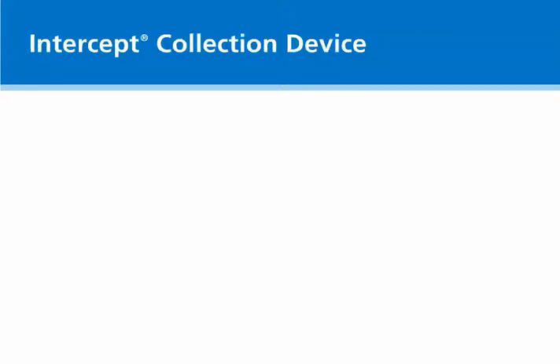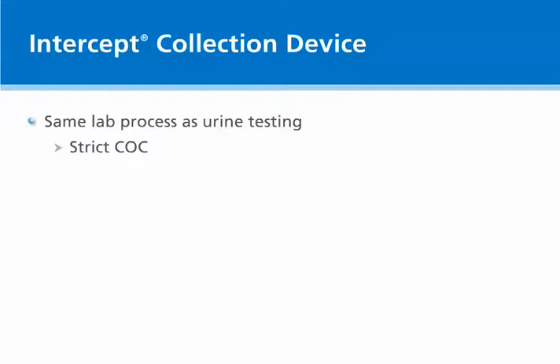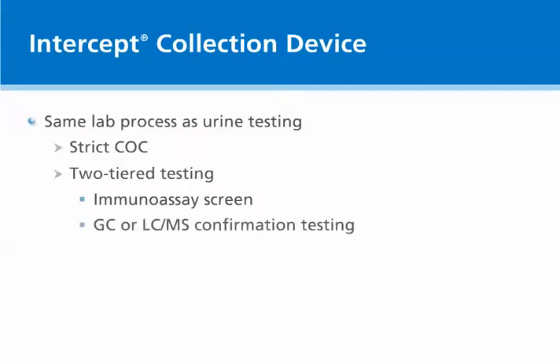Intercept oral fluid drug testing goes through the same lab process as urine testing. The collected sample follows the same strict chain of custody as urine samples. The lab also runs the same two-tiered testing process. The sample first goes through an immunoassay screen where all negative samples are reported. Then, presumptive positive samples are confirmed by gas chromatography or liquid chromatography and mass spectrometry testing.